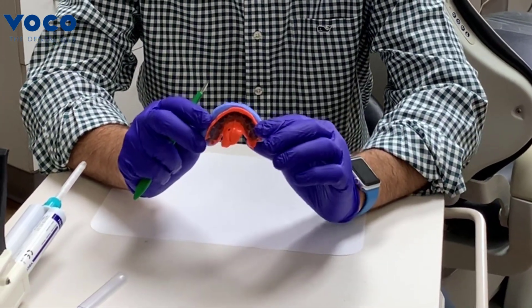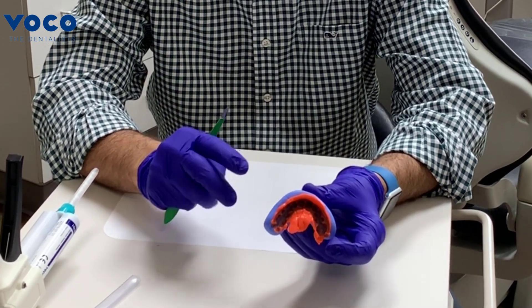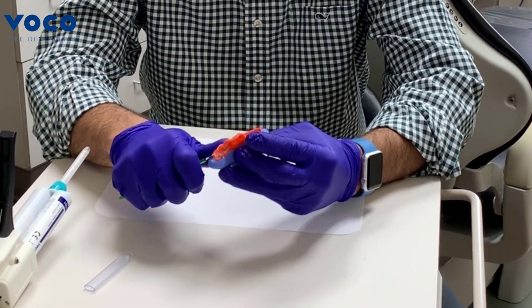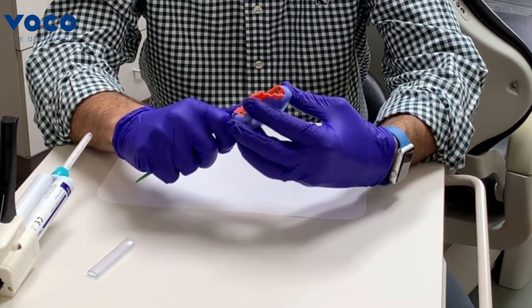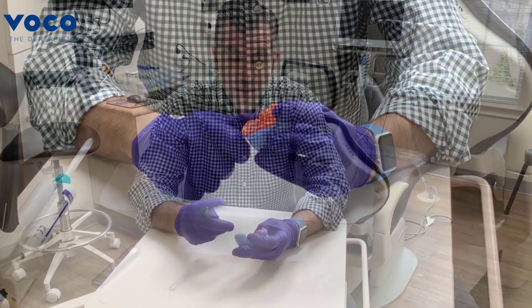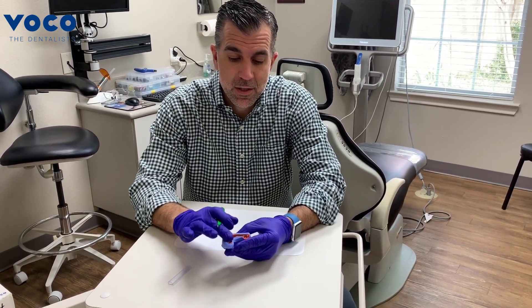We've separated our heavy body and light body from the wax-up, and this is what we end up with. Next we're going to trim it. The first thing I want you to do is trim the excess off — I like to use a disposable 15 blade to do so. Just make sure that you stay away from the margins. We'll show you the final trimming and then you'll be ready to utilize your putty matrix. We've gone ahead and trimmed the excess off and made a nice clean cut all the way around.